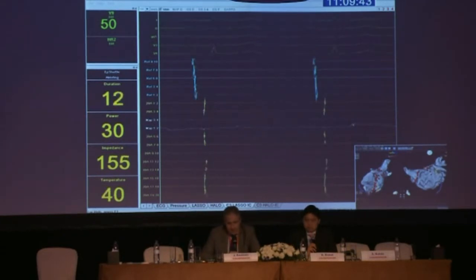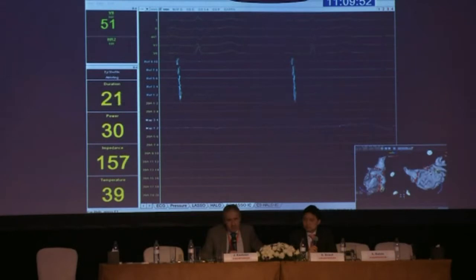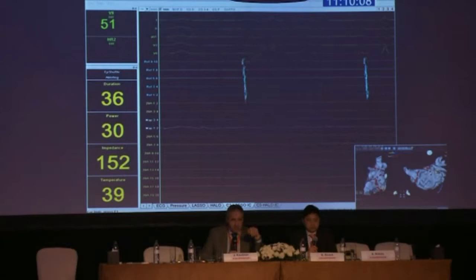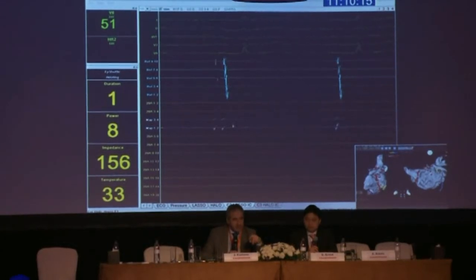Interesting observation came out from our experience when we did studies with Endosense technology and remapped the patients after 3 months. It came out that even if you measure contact force and carefully apply these criteria so that you have a reliable FTI, you still have some gaps that can occur, especially if you jump with the catheter back and forth. So if you leave some areas like gaps and then you come back to this area later on.